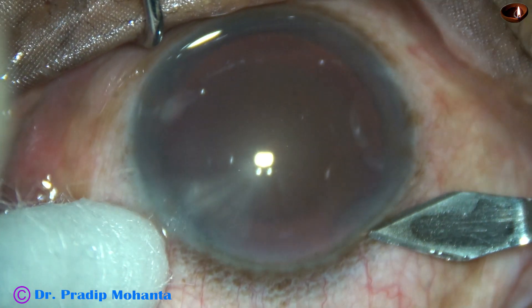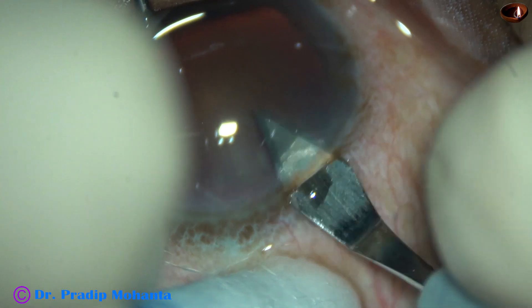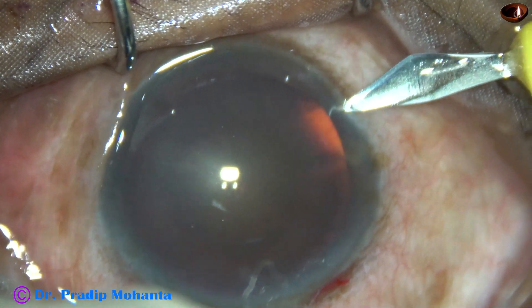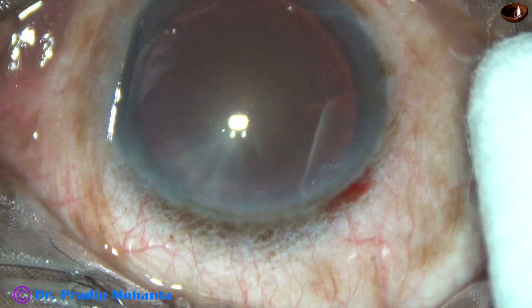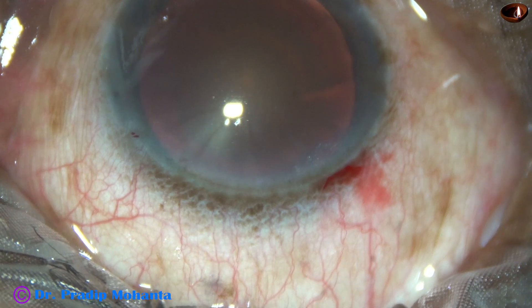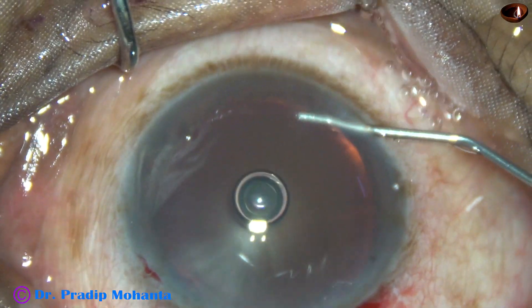This is the main incision with a 2.8 mm steel keratome at mid-limbus. Now a side port on the right side of the main incision and another side port on the left side of the main incision. These side ports are about 2.5 to 3 o'clock hours away from the main incision.